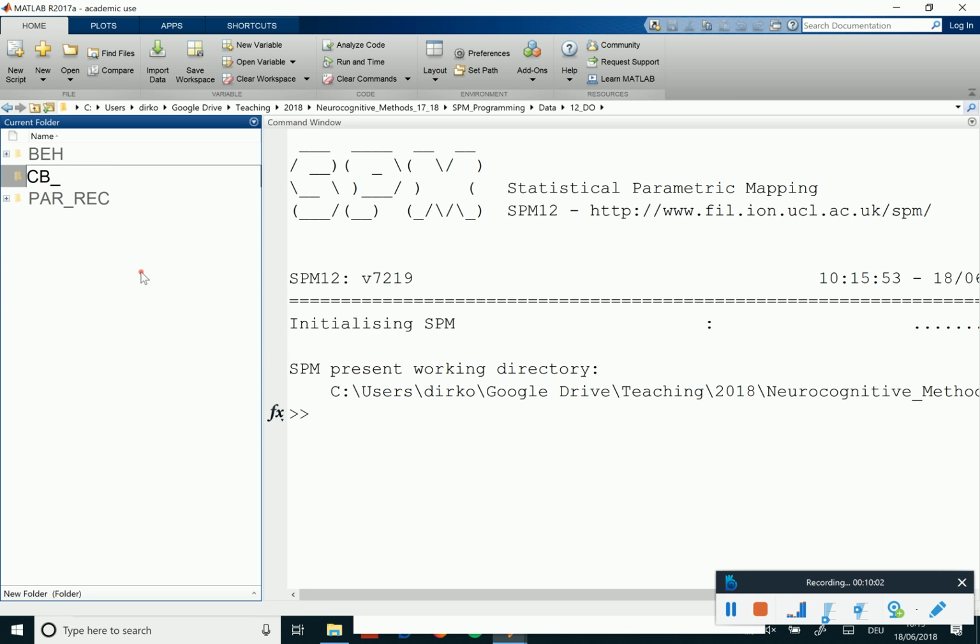Actually, for the SPM analysis, BIDS does not apply that much, because BIDS, the standardization, really refers to the raw format. Everything else that you do with this raw format is not in BIDS and is what is called derivatives. And there you can again go synchronously, but you can also try to follow BIDS in this regard.